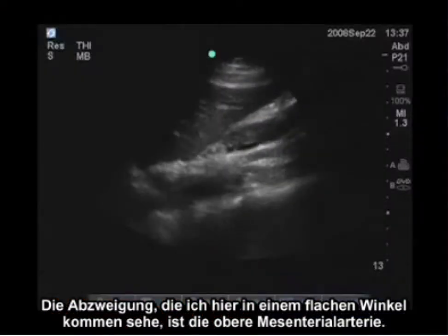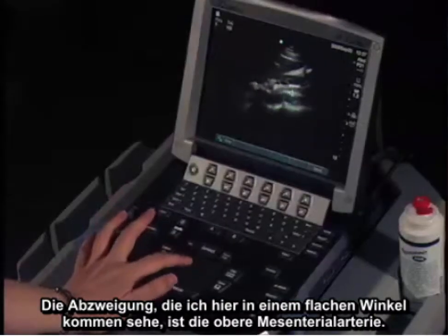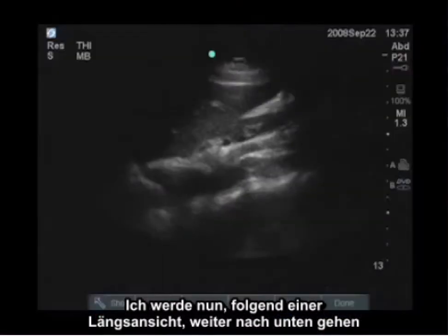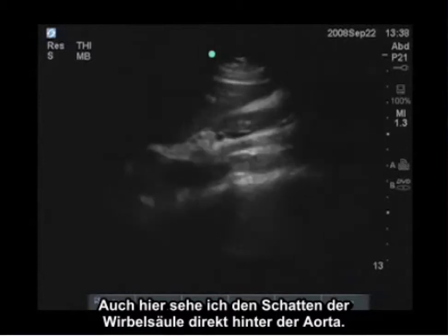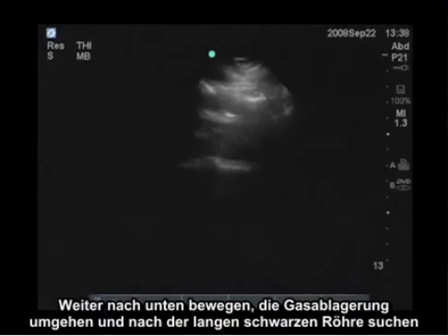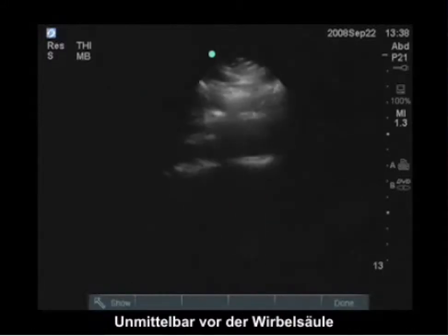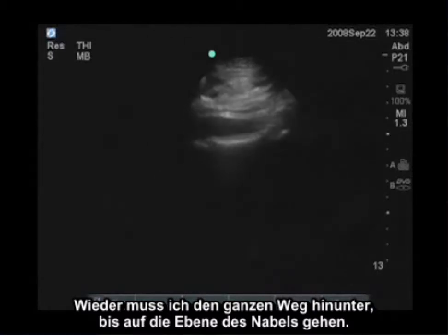The branch I'm seeing here coming at a shallow angle is the superior mesenteric artery, so I know I'm above the level of the renal arteries when I see that landmark. I'm going to continue down, following it in a longitudinal view. Again I see the shadow of the spine directly posterior to the aorta. I keep moving down, working around the bowel gas, looking for the long black tube immediately anterior to the spine, all the way down to the level of the umbilicus.